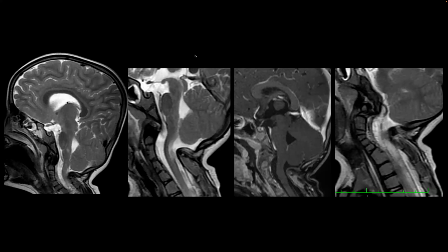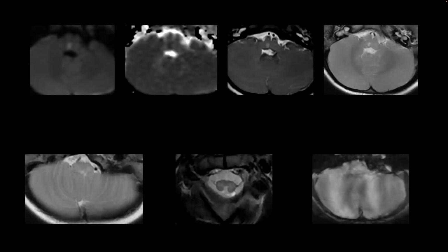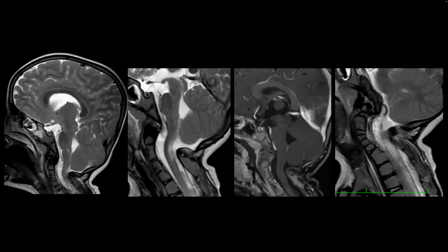Nihaal, may I come back to the previous slide? Yes, please. Axial. In the middle, is that kind of a spinal dysraphism? It's almost a diplomyelia, is it? You mean this part? Yes. If you do the sagittal through that area, it mimics a longish T2 hyperintensity, which is not, in fact, an infarct, just CSF. That is not the infarct. No, that's not the infarct.